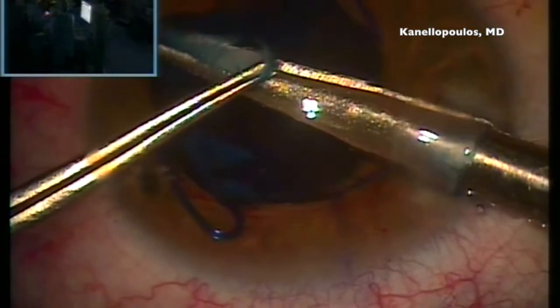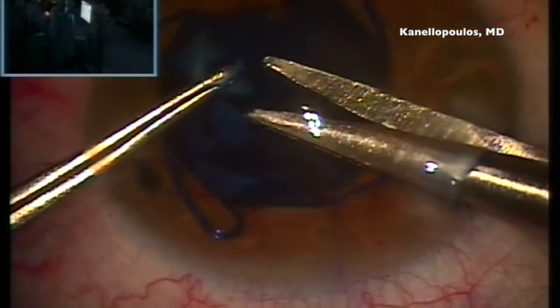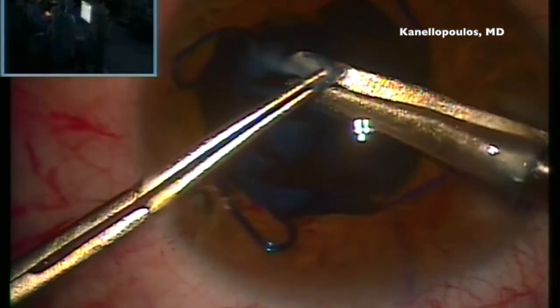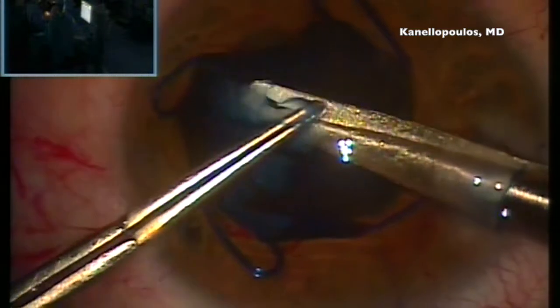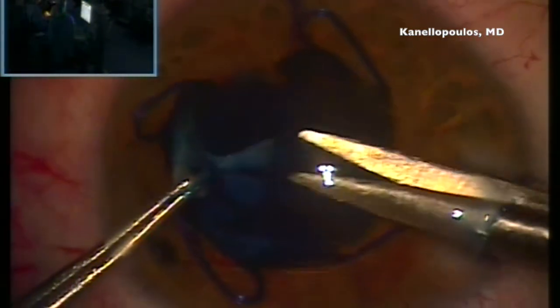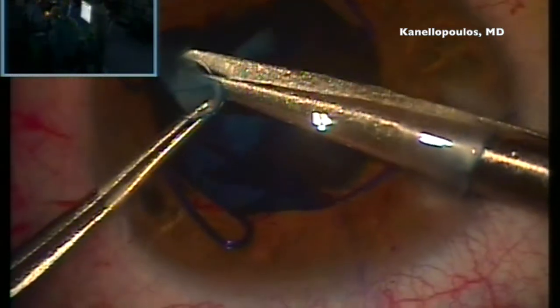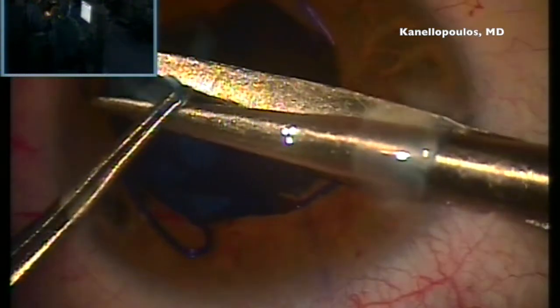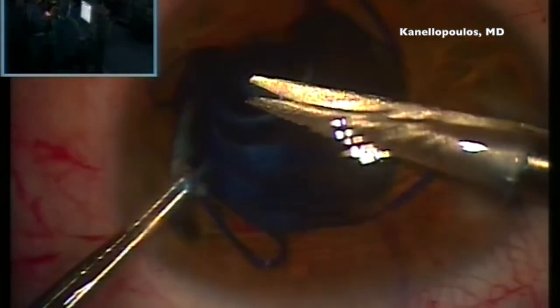I know it does not look very pretty in comparison to a continuous round curvilinear capsulorhexis. Always wondered how something curved can be linear. I would go more with circular, but in any case, I will not change ophthalmic nomenclature here, just because we're native in the Greek language that is used in most of the nomenclature in medicine in general and ophthalmology as well.